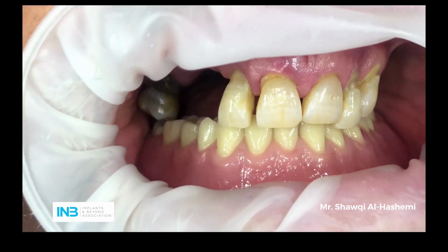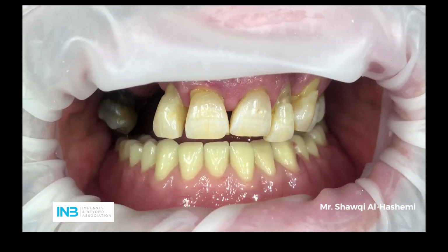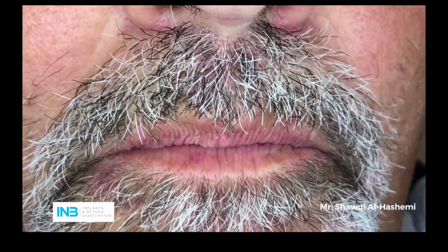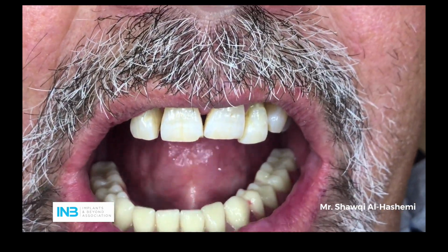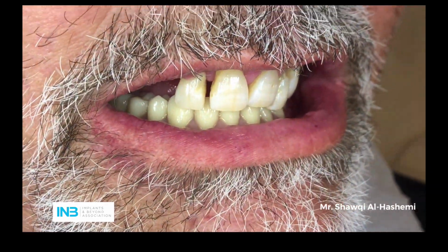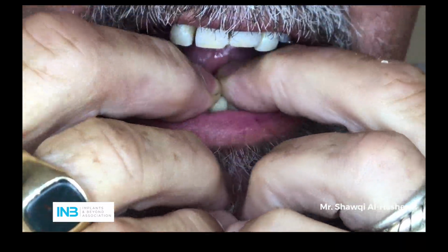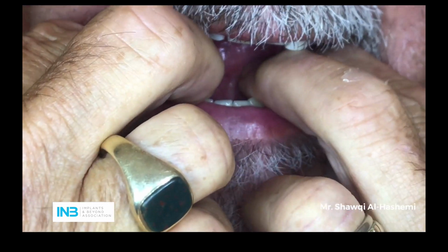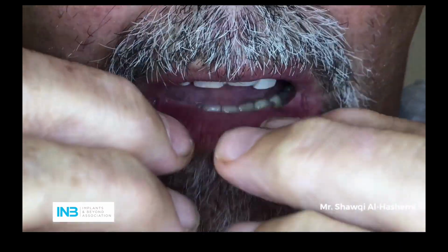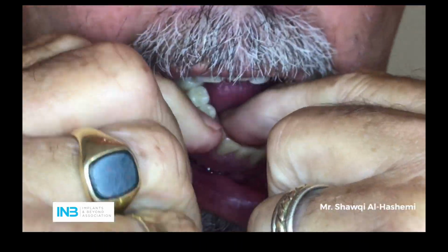Close. And open. And close. Good. Now, give us a big smile. And open. And bite. Brilliant. Big smile. That's how you take it out. Good man. All right, and stick it back in again. Open and bite. Good man. Take it out. Excellent. Well done.